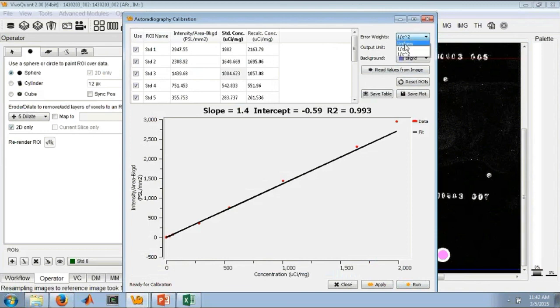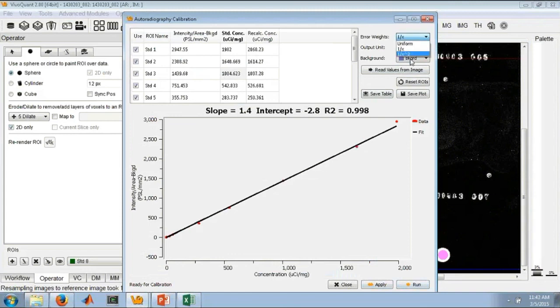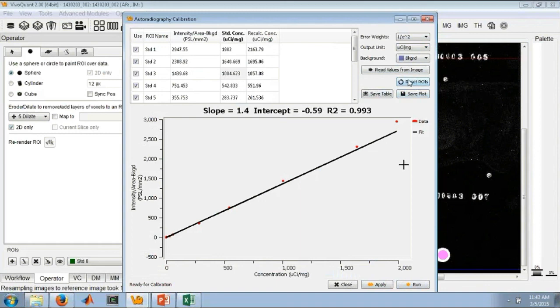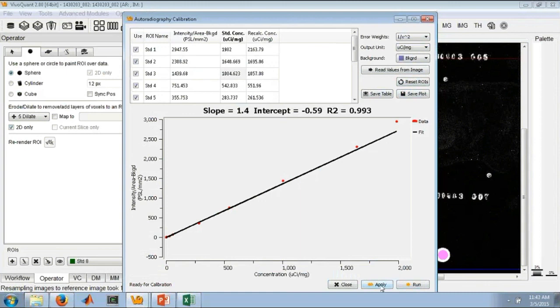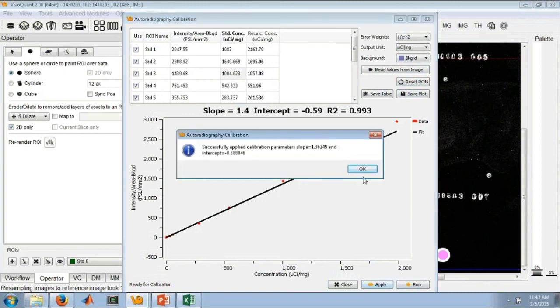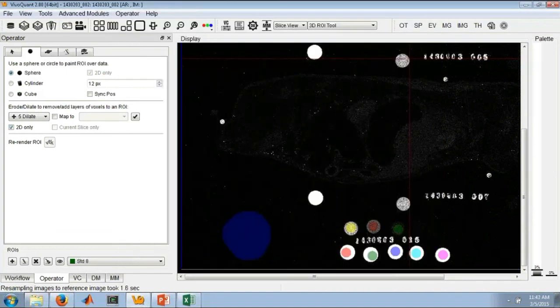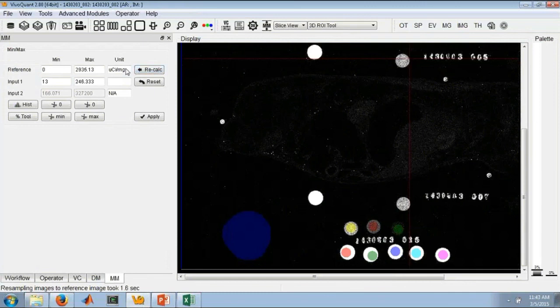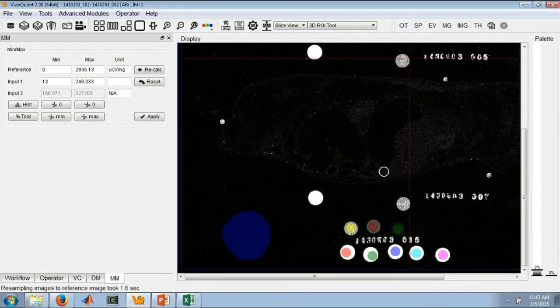We can also save this plot, as well as this table, using these buttons. We can also reset the ROIs and start over. But we like the fit curve. We simply say apply. It will tell us what calibration was applied to the data. We say OK. And now if we check our MinMax tools, you'll see that we've now changed the values to microcurie per milligram, real-world quantifiable information.